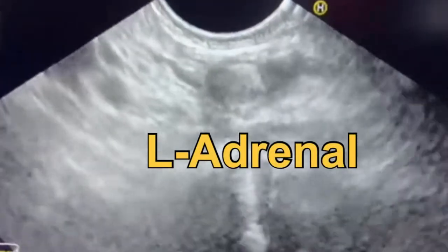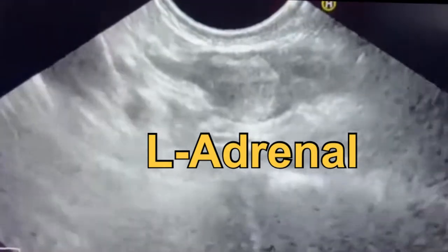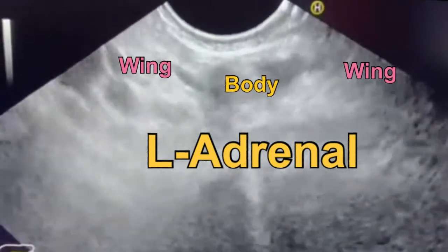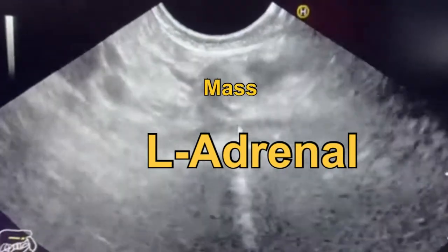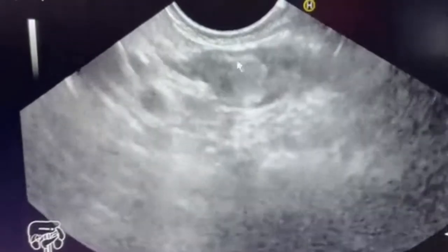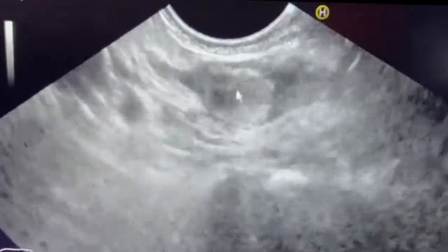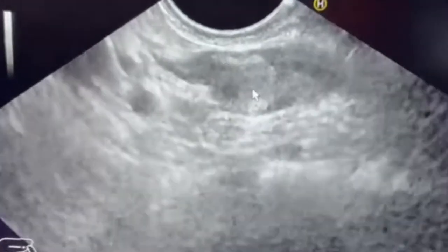This is the left suprarenal gland in a patient with diffuse abdominal pain and diarrhea. Here, this is the left suprarenal, and this is an accidentally discovered small lesion showing the seagull appearance of the left suprarenal.